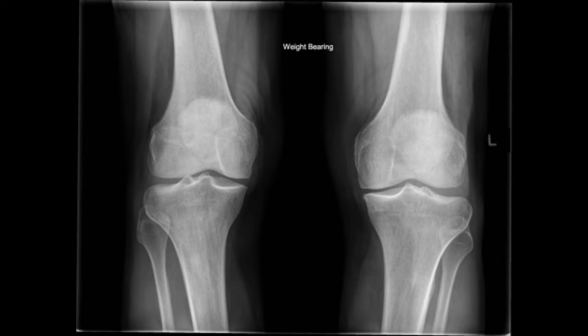For suspected osteoarthritis, AP projection, weight-bearing method, standing. Adjust the patient's position to center the knees to the IR. Ask the patient to stand straight with knees fully extended and weight equally distributed on the feet.